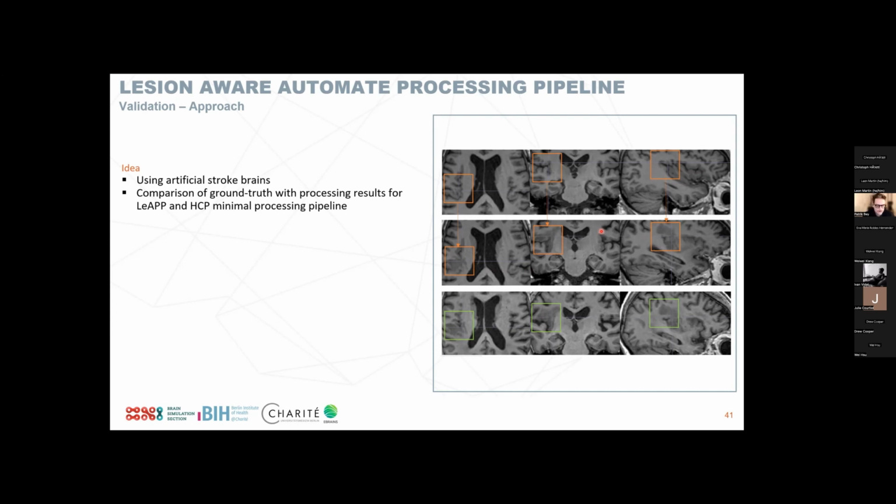And the idea we had here is that we don't want to only deal with lesions that we know are not representative of the actual patients that we see. Because if we are instantly able to differentiate them, there are reasons for that, right? They are very pixelated, or too round for an actual lesion. So our methods may be able to process these simplified versions of lesions, but not the actual ones.